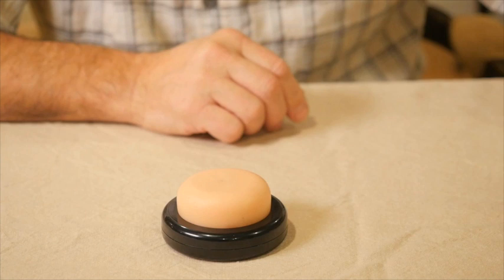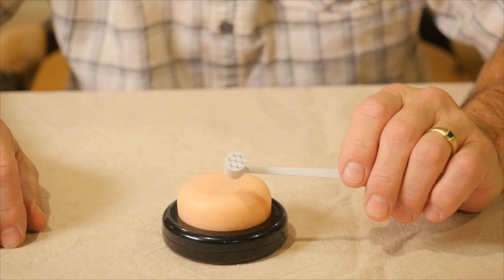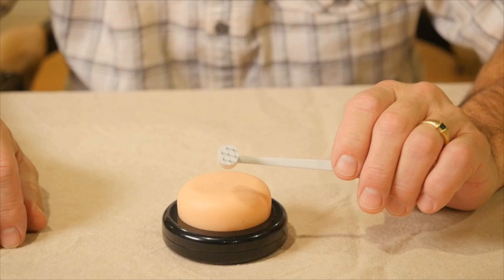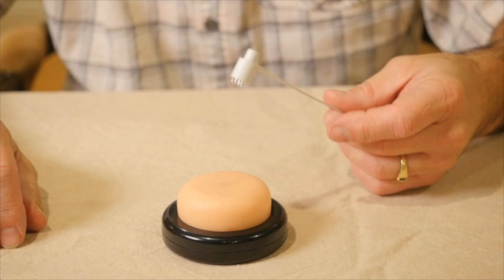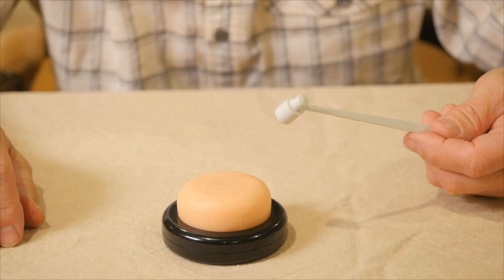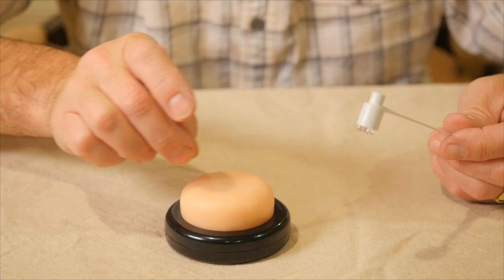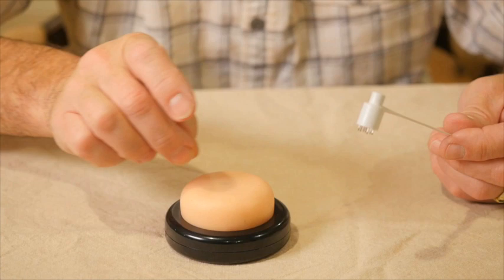One other type of bleeding needle is the seven-star or plum blossom needle, which has seven small needles on a hammerhead attached to a flexible handle. It's used to stimulate large areas. For example, with herpes zoster or shingles causing pain over a large area, you can tap many points at once and see small drops of blood. It's not a comfortable treatment, but it can be very useful in certain painful situations.